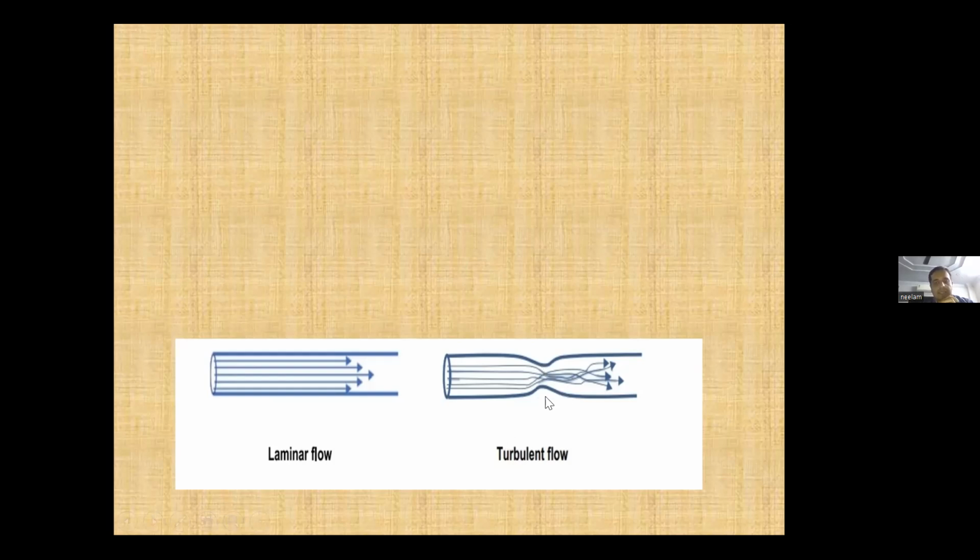Second, whenever there is narrowing of the airway for some reason, many times if the ET tube is kinked, or there are secretions or partial blockage of the endotracheal tube, all that will increase the airway resistance. Why? Because firstly, the diameter of the airway decreases. The endotracheal tube is acting as an airway, so the diameter also decreases. Secondly, the flow which was laminar until now will become turbulent beyond the point of obstruction, and as soon as it becomes turbulent, the resistance increases.